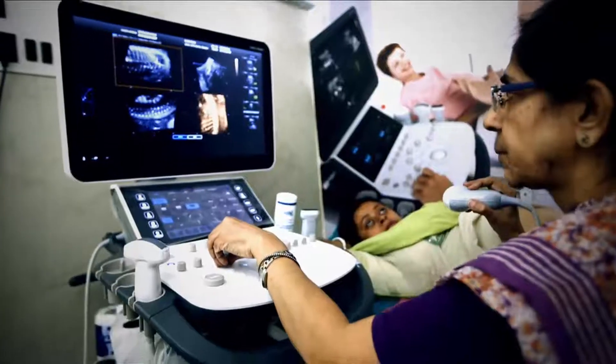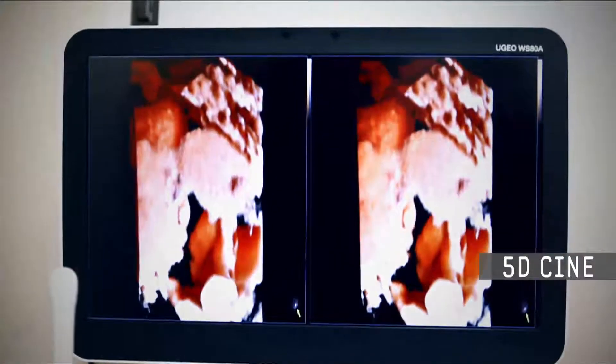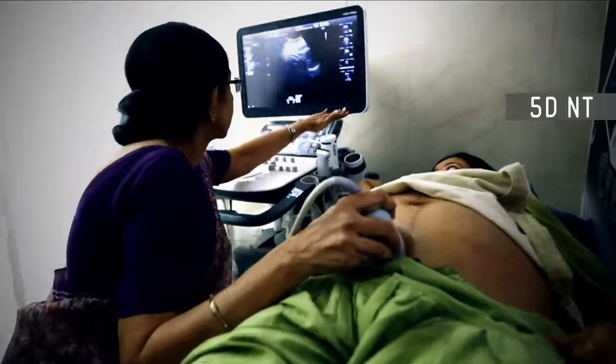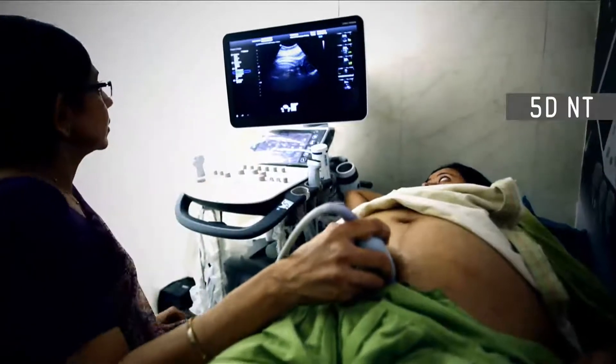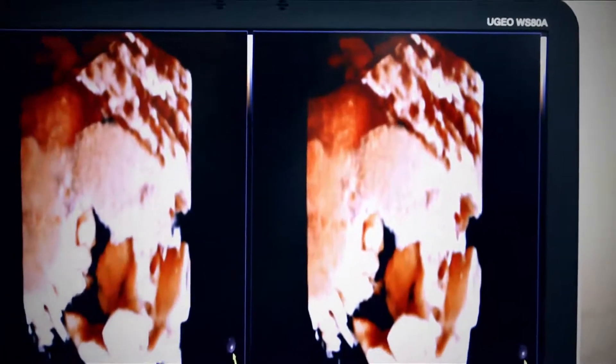They have add-on features on the machine. They allow us to have 3D reconstruction, 5D Cine, 5D long bone measurements, and 5D NT automated measurements. What is happening is it reduces time per patient. The 3D is very good as well.